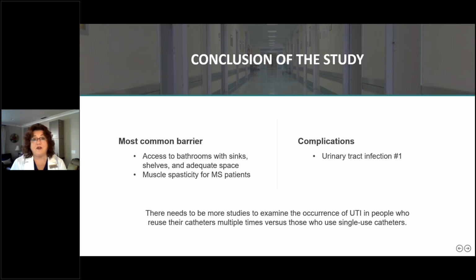Those of you who are out there doing your PGPs and whatever else, you need to do studies on this, because we need to look at the occurrence of UTIs in people who reuse their catheters multiple times versus the ones who use single catheters.